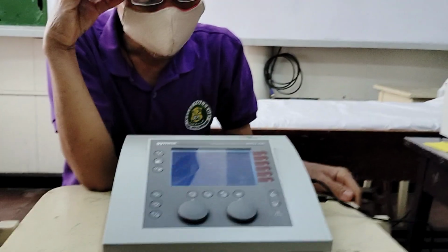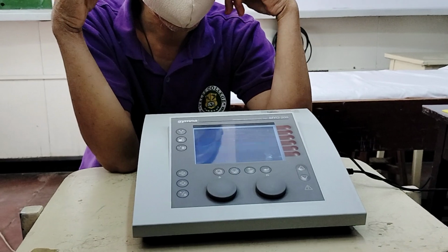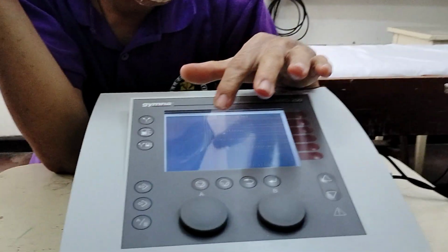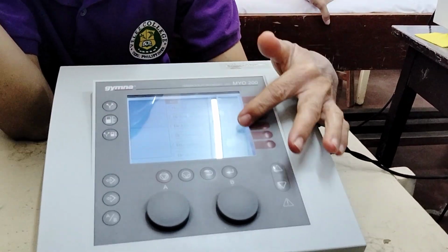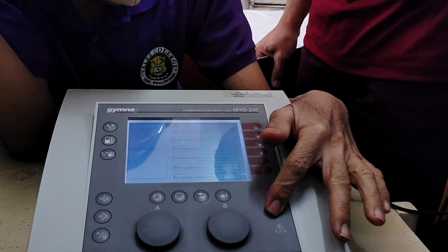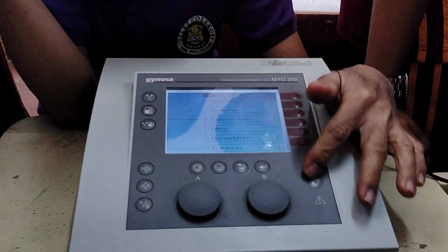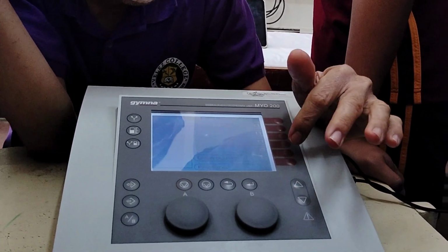Okay, so here. One of the advantages of this modality is that it has pre-programmed parameters for certain conditions. For example, here, the indication. When you press that one, it has cases like arthralgia, arthrosis, and if you further choose, bursitis, arthritis, epicondylitis. If it is epicondylitis, you just press that one.